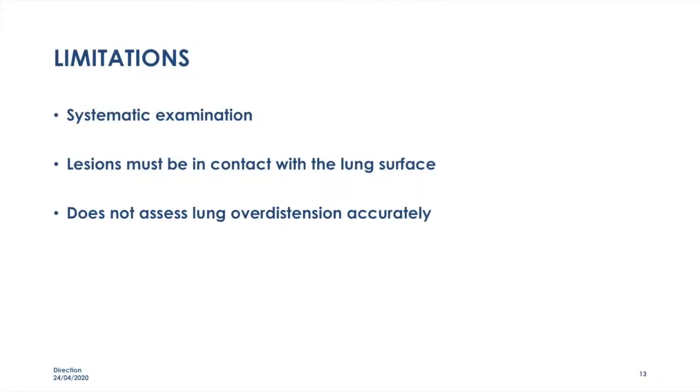However, there are some limitations in lung ultrasound. It needs to be a systematic examination. You need to explore all lung areas as with an X-ray, and we cannot assess lung overdistension yet. Many people are working on that. So if you want to assess overdistension in a baby on HFOV, you still need to request a chest X-ray.